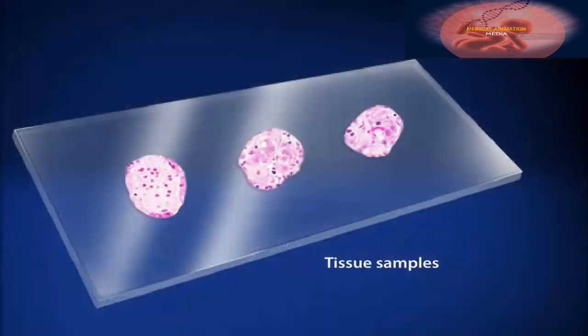When the procedure is complete, the speculum is removed and the patient is allowed to go home. The physician will provide after-care instructions and, if a biopsy was taken, will follow up with lab results.